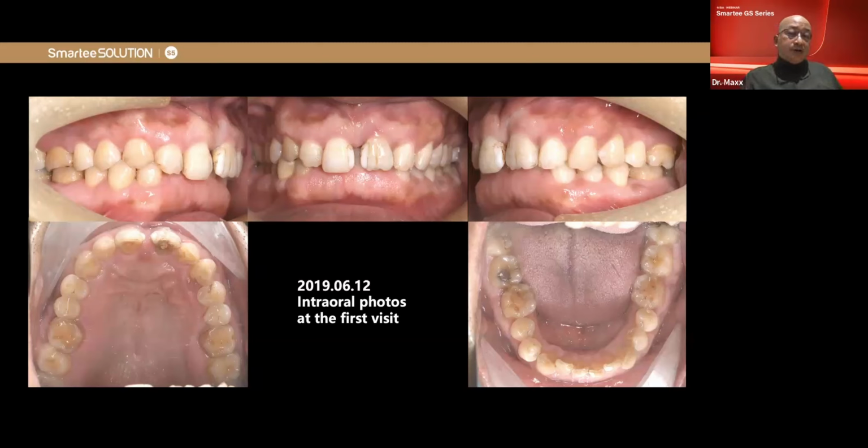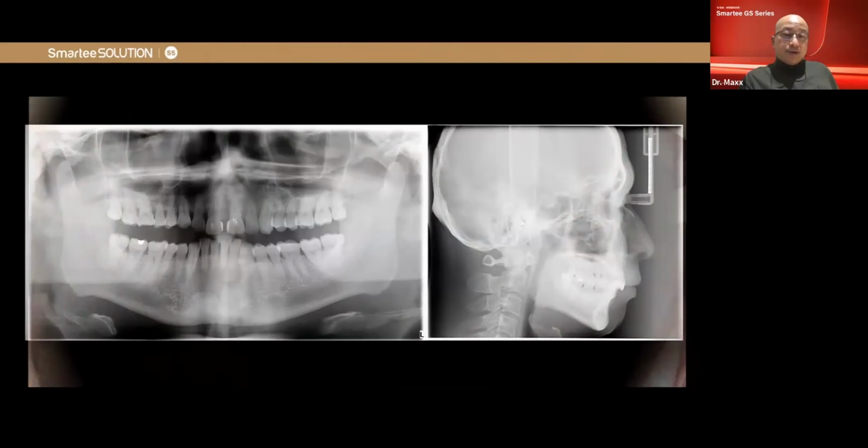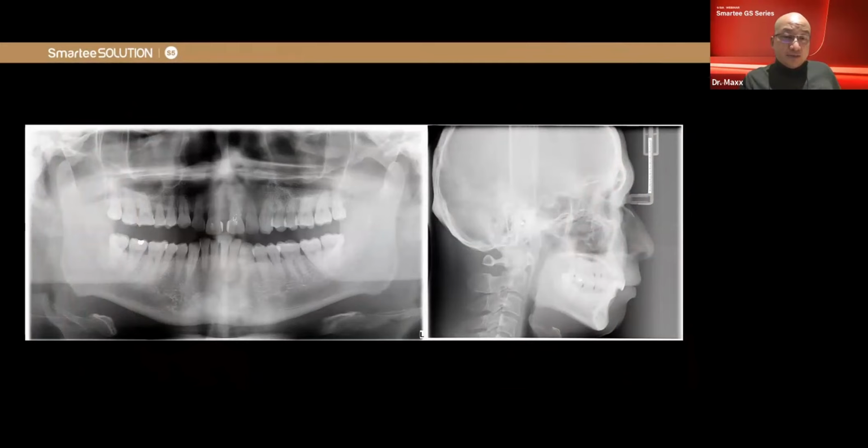At first, maybe there was quite a small space, and the patient repaired the space with resins. But unfortunately, gradually, the upfront teeth got more space here. So they moved a lot of distance. And in the OPG, we found that the two teeth have almost no bone around them.